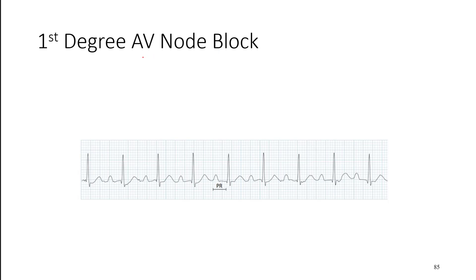Looking at a first-degree AV node block example on the ECG: we've got a normal-looking P wave, normal-looking QRS complex. Let's calculate our PR interval. From the start of the P wave to the Q wave, our PR interval should be no longer than 0.2 seconds or five small boxes. We can already see this one is already longer than 0.2 seconds just at a glance.